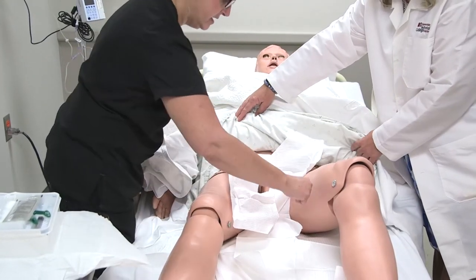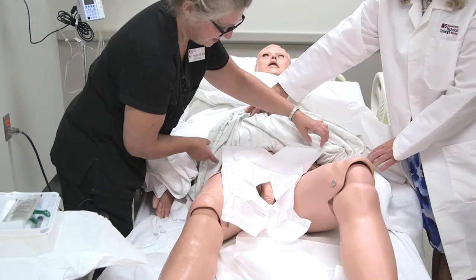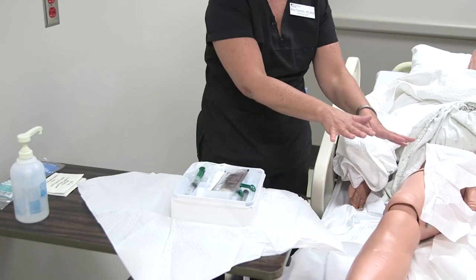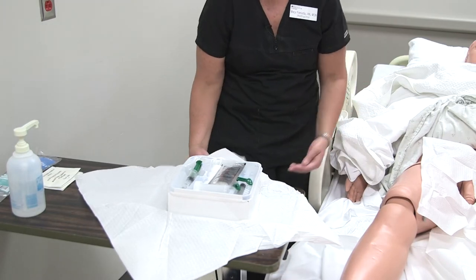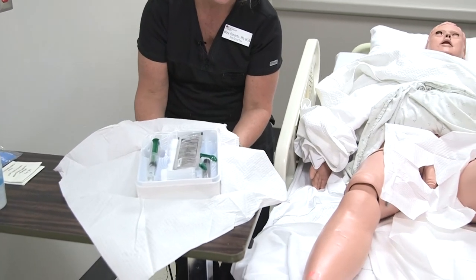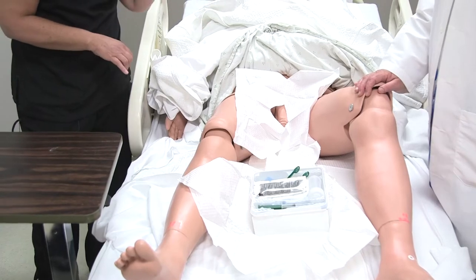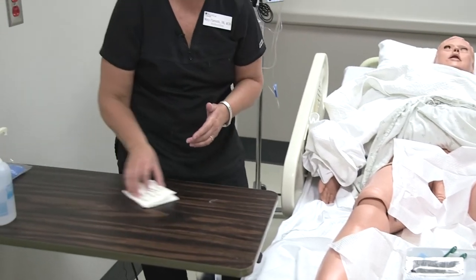All right, okay, so there we go. Now the next thing I'm going to do is I am a person that likes to put all my supplies right near me there. That will keep me from turning constantly and stepping away from my sterile field or looking away from my sterile field. So I just grab underneath, because underneath is not going to be sterile anyway, and I lay this down on the bed like that. All right. So now everything there is sterile, and my assistant's going to help me make sure the patient isn't going to move to get on that sterile field.